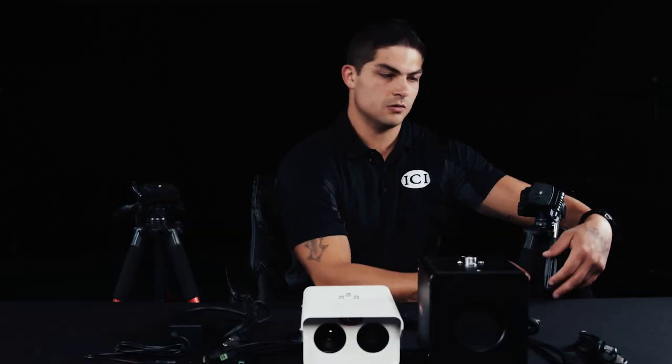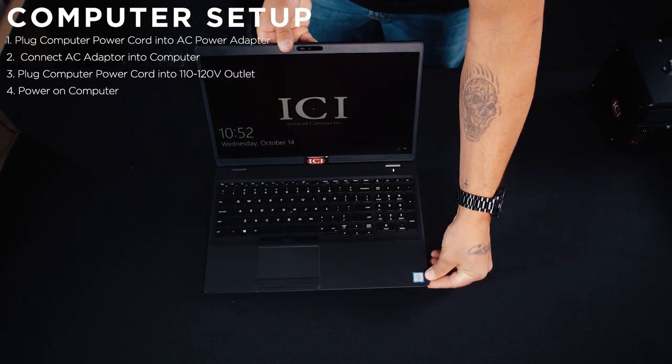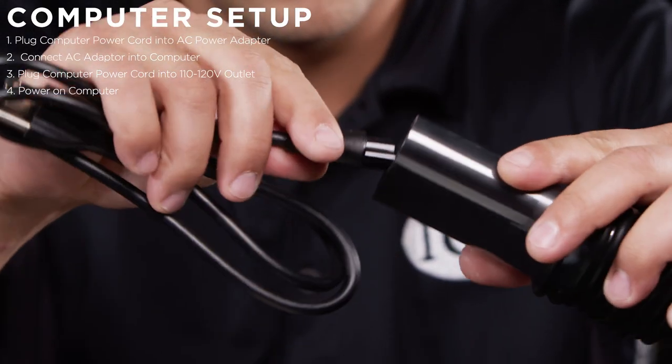Adjust the height and lock in place. Ensure that all is level, then follow the same steps to set up the other tripod. This is a basic computer and the steps to set it up are very simple. First, plug the computer power cord into the AC power adapter.